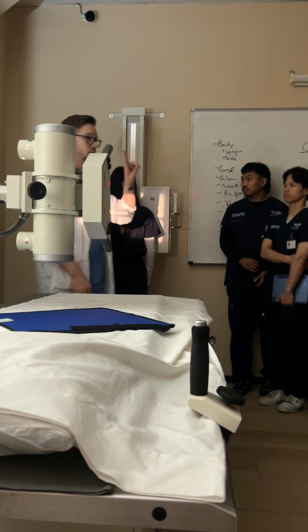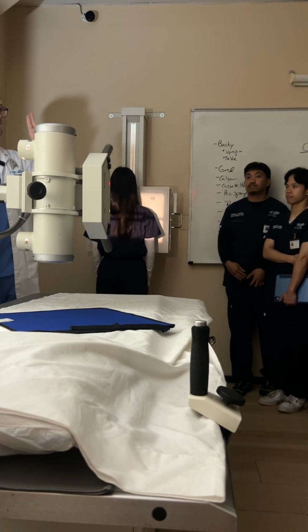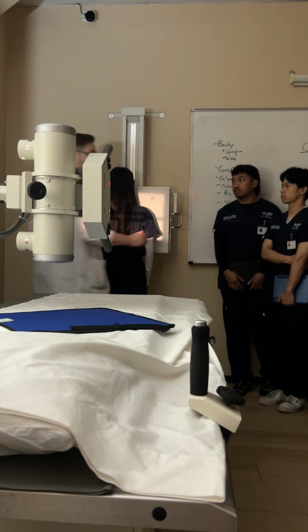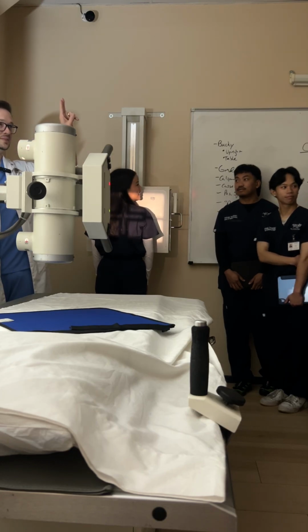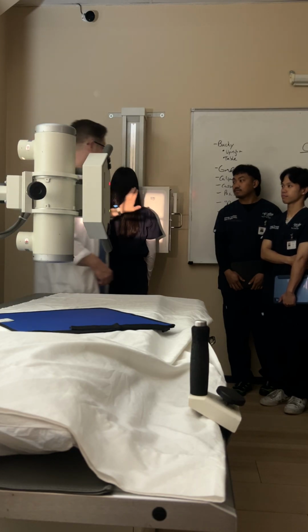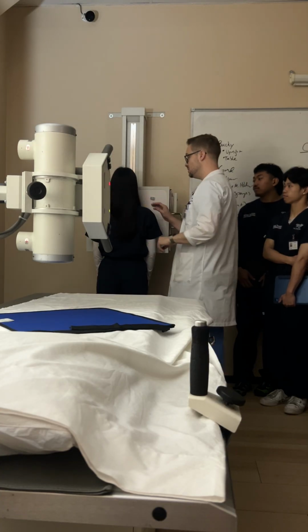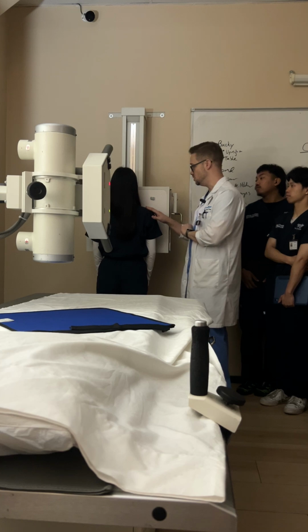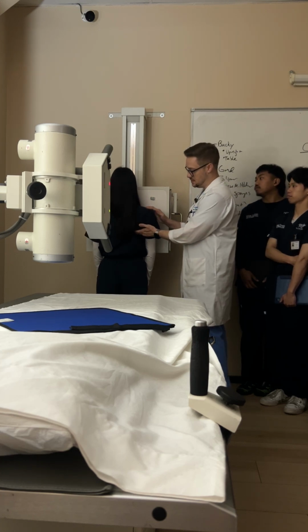First thing I'm going to do, palpation. Palpation is simple. Palpation is not invasive. What do I mean by that? I don't walk up to her and go, okay, sorry, nothing intended, okay? So I'm going to get to that point, all right? I am going to find where I need to be centered for my x-ray, so you're going to feel me touch your back, okay? Simple! T7, right there.